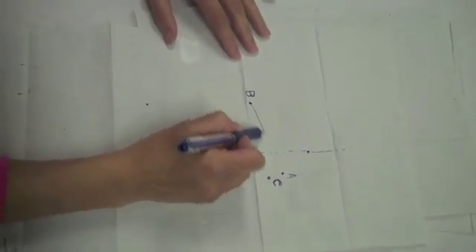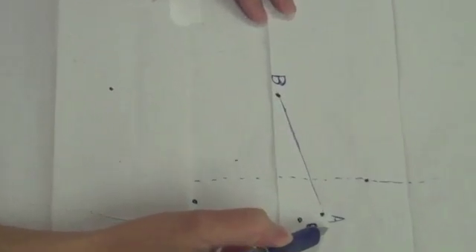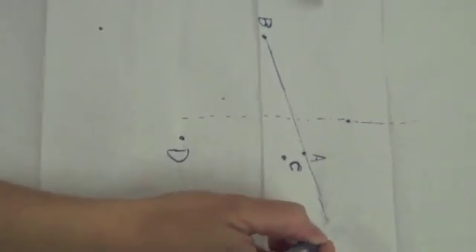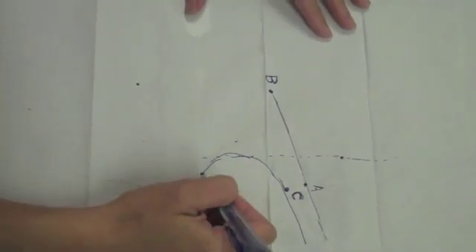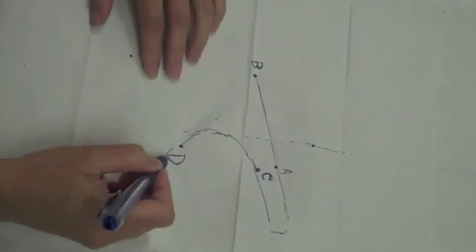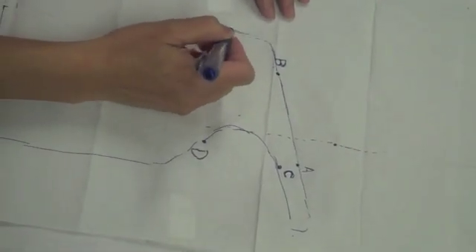Connect points B and A with a straight line, slightly extending the line out from point A. Continue down from the end of line A and connect it to point C. Make a line that curves inward to point D. Extend the line downward from point D to the two-thirds mark of the forearm. Do the same on the opposite side of the splint.